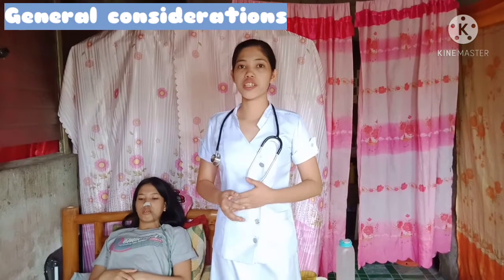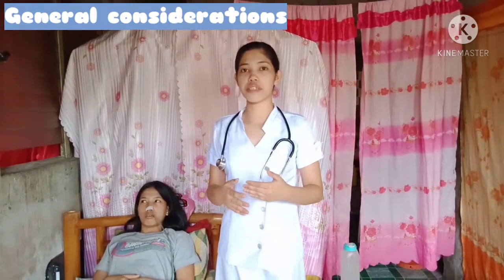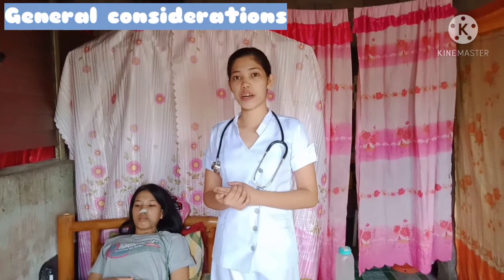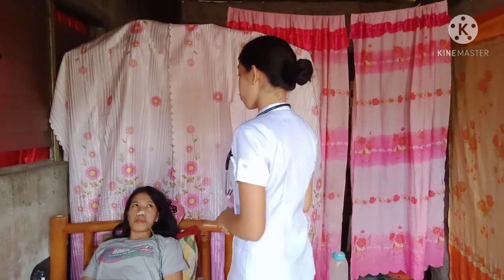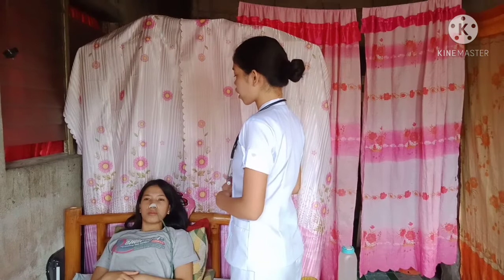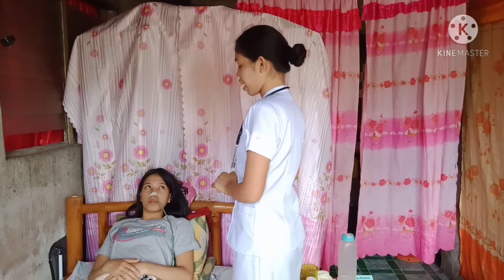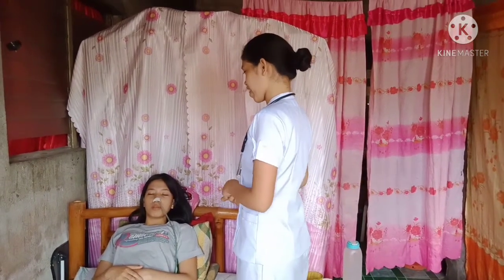For the procedure, first we have to explain the procedure to the client, since explanation helps allay anxiety and also encourages the patient's cooperation, and lets the patient know what to expect. So for today, I'm going to perform nasogastric tube feeding, and I'm going to administer all the nutrients ordered by the doctor, and also your medicine in solution form. And all you have to do is follow the instructions, okay? Next, we have to perform hand hygiene and wear gloves, since hand hygiene deters the spread of microorganisms.